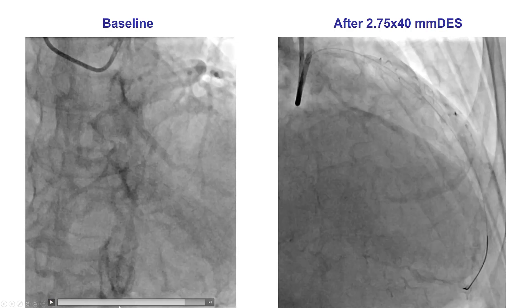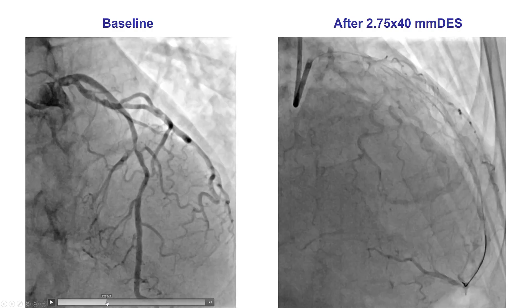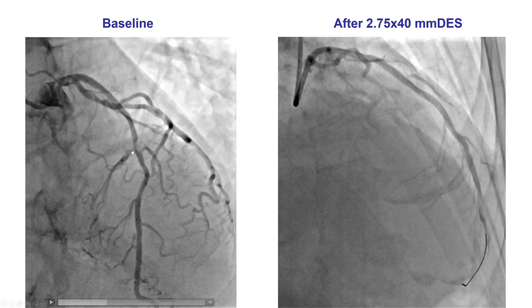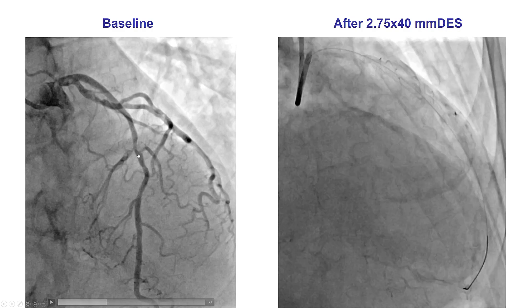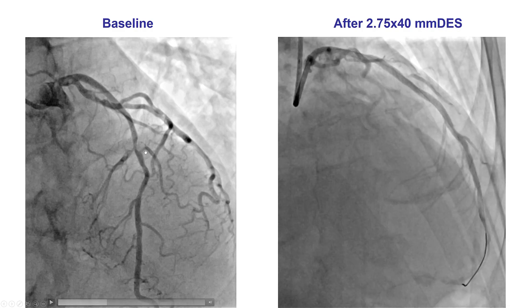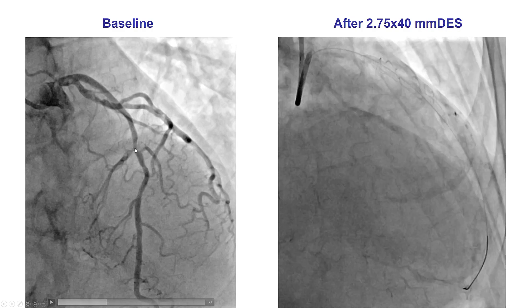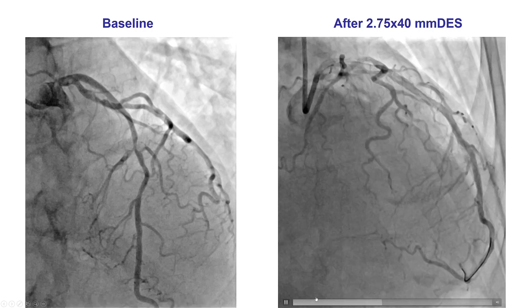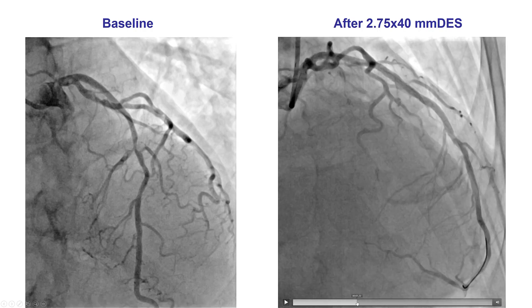This is the image before, showing that there is a septal branch that originates within the lesion. The septal is originating immediately proximal to the takeoff of this diagonal branch. In the picture taken after the stent, here is the diagonal branch and we see that the septal is missing.